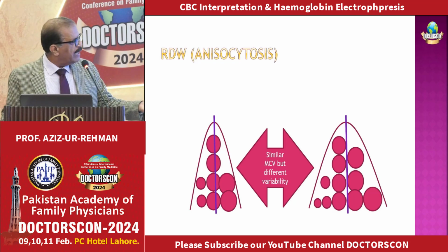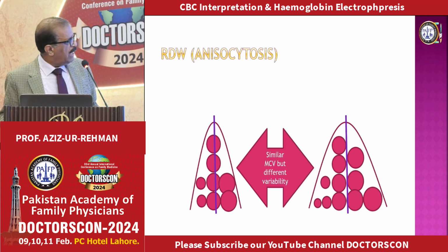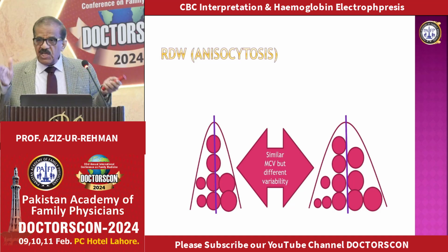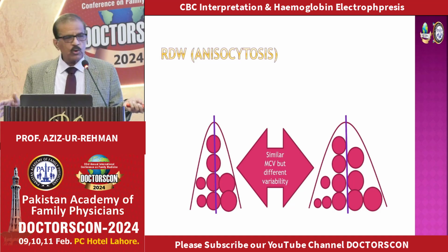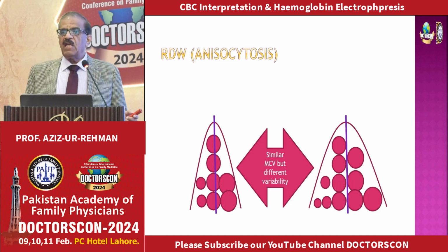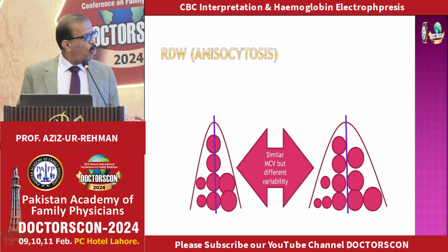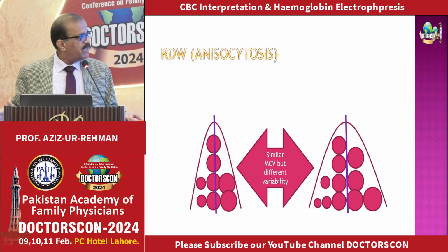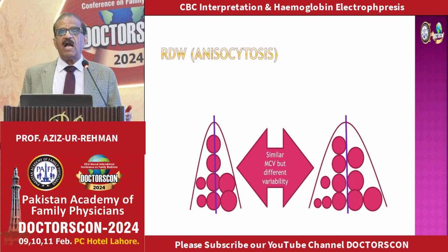So it will be a narrow distribution. But here, the average cell size is the same, a microcytic picture, but the variation within the cells is more. So although it is broader, this would have increased RDW. Both may be microcytic of the same degree, but this would have greater RDW.